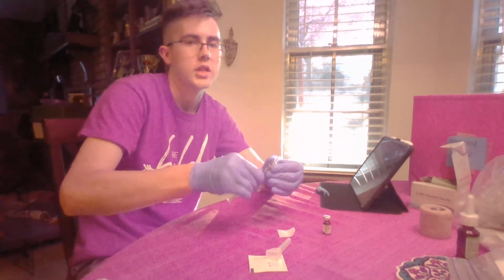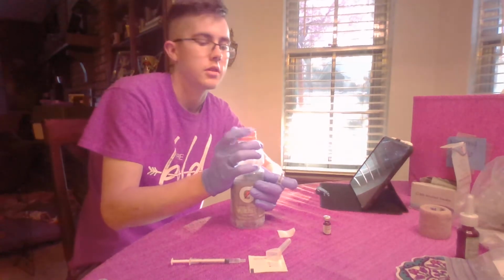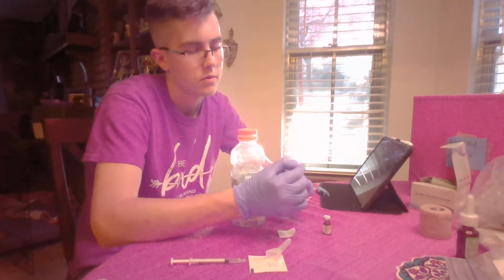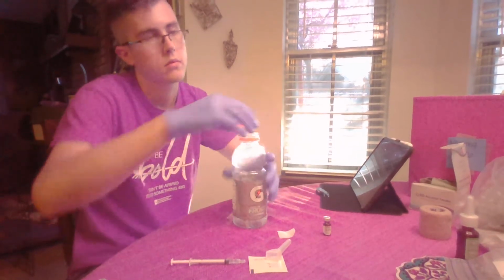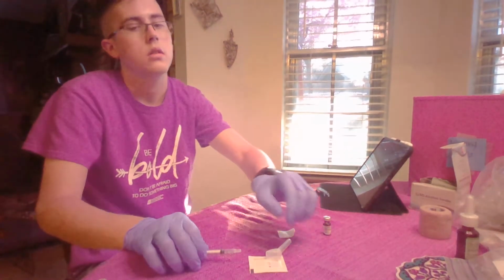Okay, take this, put it in the sharps container. Since this was my 5th attempt, I am actually going to be placing it in our sharps container. I have another one.